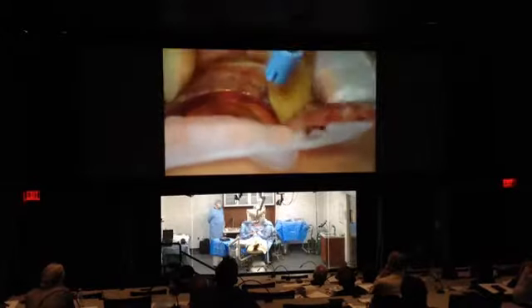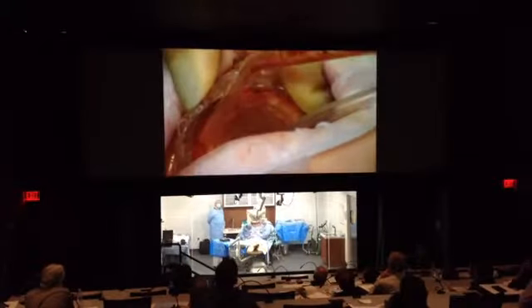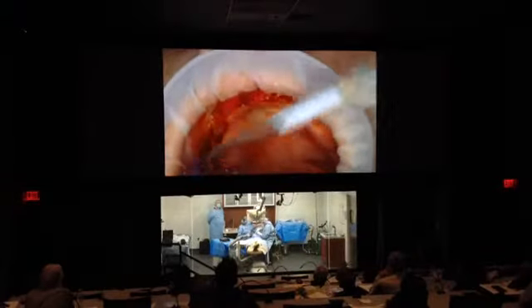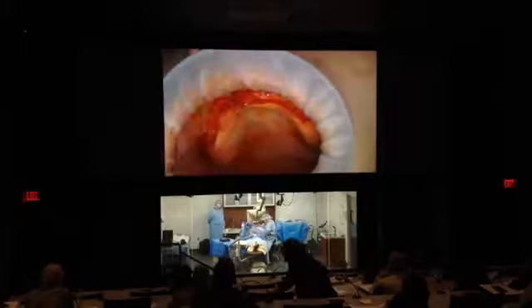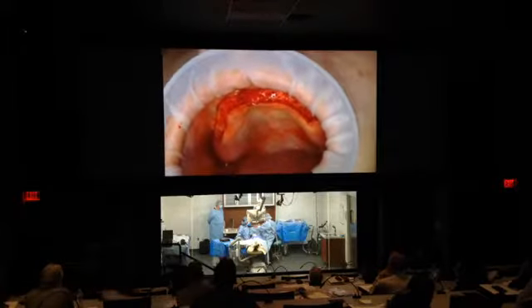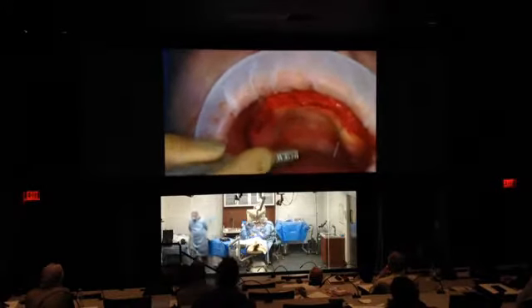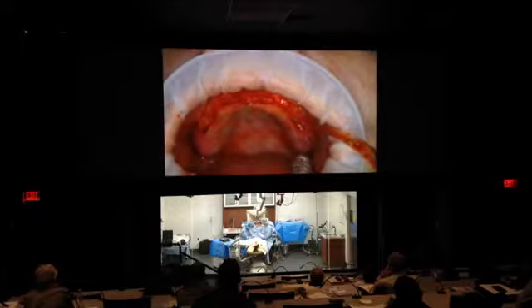Let's mark the other side just to get an idea. Turn towards me a little bit. Ana Maria, turn my way. Good. All right, same thing here. So here we are. We have 2 points here. I always start with the most posterior implant. Let me have a probe. One here. You can turn your head back. Perfect. Suction here. And one here. Okay. Looks good. Did we find a guide?